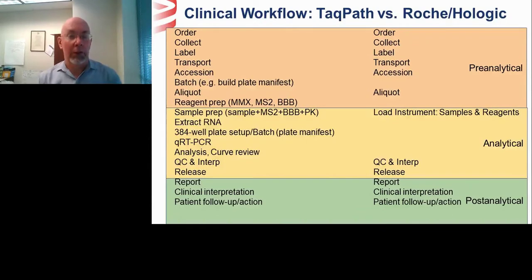And in fact, that's been a struggle across the molecular space as the pandemic has unfolded globally. But Thermo Fisher, in our experience, has done a very good job of not having supply constraints or being able to source alternate materials like they did moving from the MVP1 to the MVP2 kits for the extraction process. But that puts a little bit more complexity back on us to manage each one of these separate process steps.